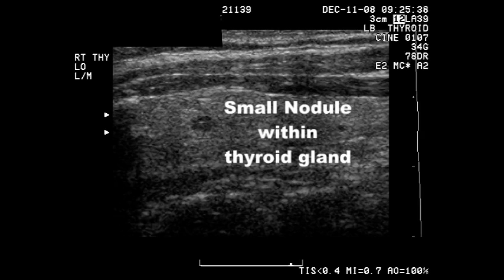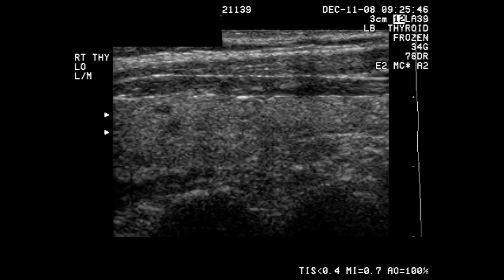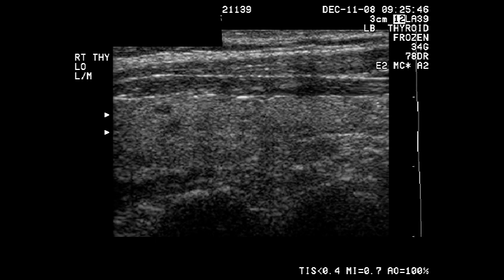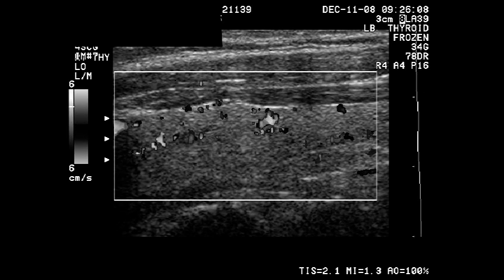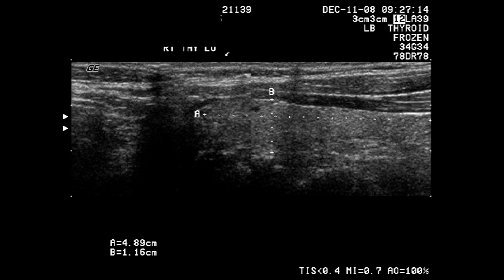A small nodule is seen within the gland. A small nodule is seen in the right lobe of the thyroid gland, measuring 0.26 centimeters. This is very small.